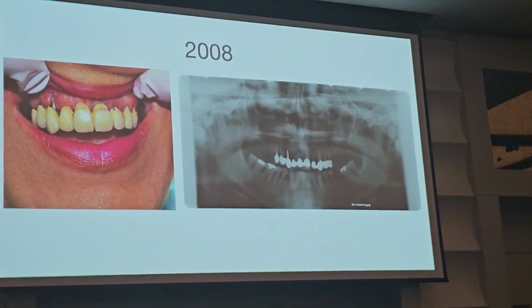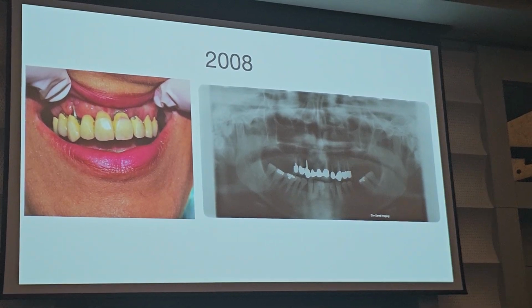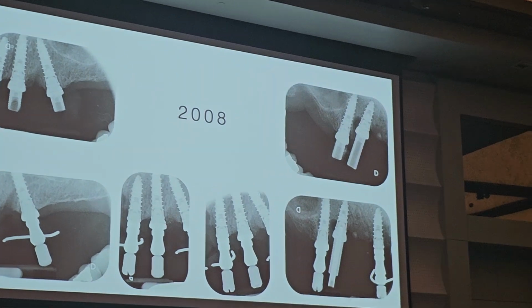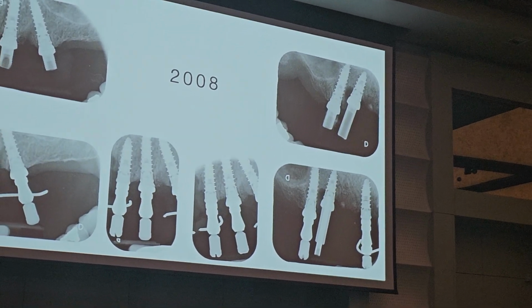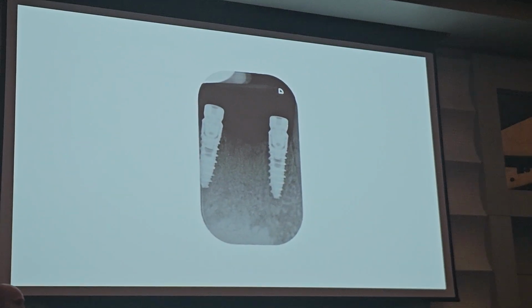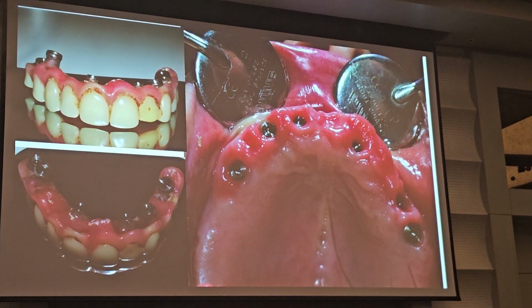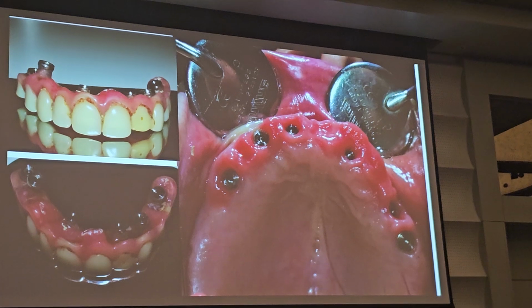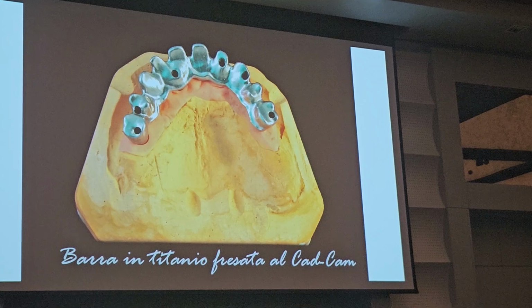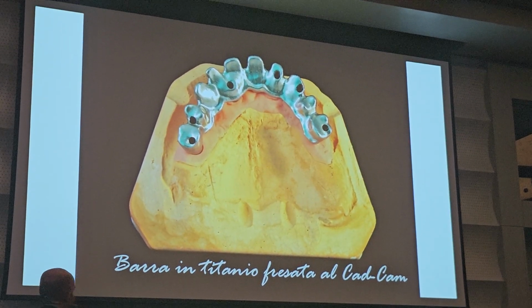So in this patient, this is the photo of the technician, look. Anyway, I decided to extract the teeth the same day to place the implants, without any mock-up, nothing. By heart. Anyway, this is the same day impression. In the same day, I placed 2 implants in the lower arch because there were 4 missing incisors. This is the provisional prosthesis after some months. We did, for the final prosthesis, a metal framework with the layering of composite.